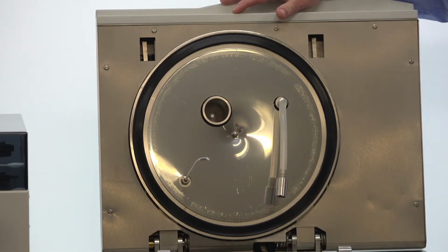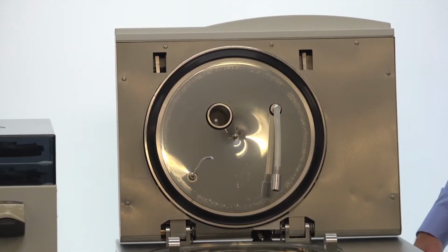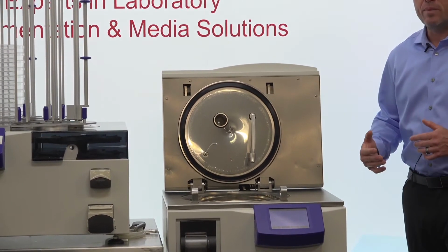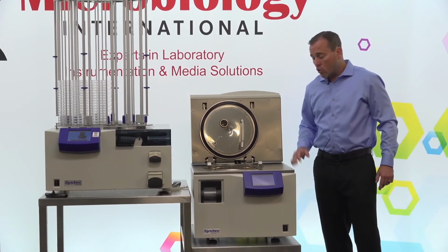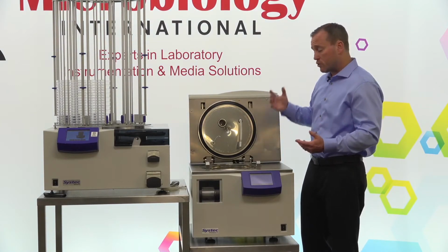That is to monitor the temperature for the entire process of the sterilization. So it will heat all the way to 121, or the temperature that you program into the system, for the time that you specify. Then we will cool it down through a heat exchanger that is located on the right-hand side of the instrument. That heat exchanger would be cooled from the DI water that flows back out of the system through the heat exchanger, and then would be cooled by tap water. Once that is cooled, that flows back into the vessel, and then we will cool the media down to the specific holding temperature that we want.